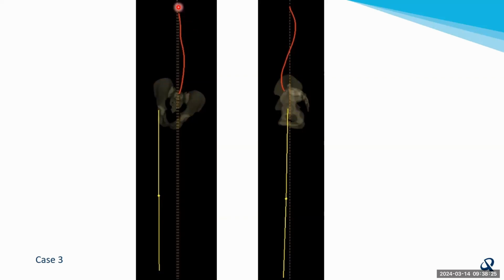And you can see here that the coronal balance comes down straight through the sacrum, and then sagittal balance comes down. They've maintained their lumbar lordosis, and again, straight through the sacrum. So impressive compensation by this pediatric patient.